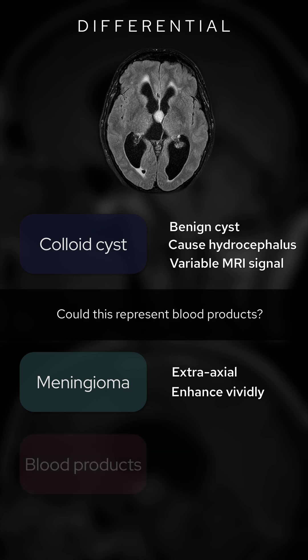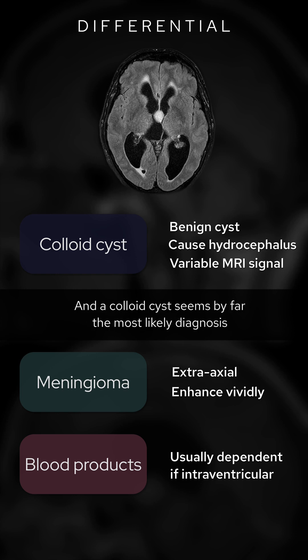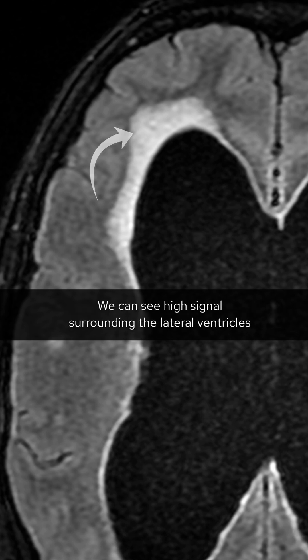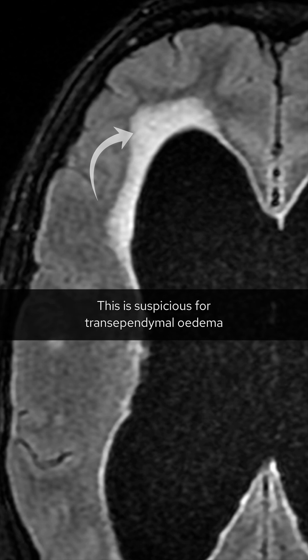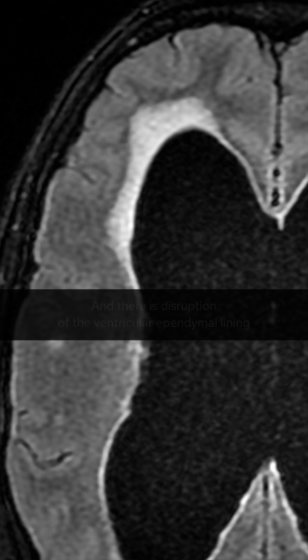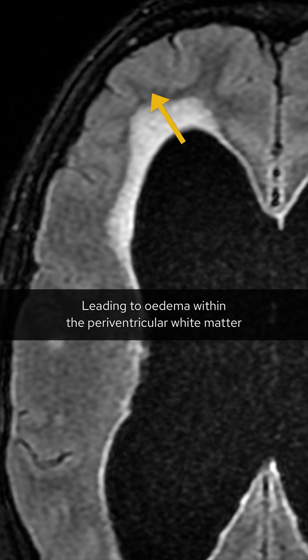Could this represent blood products? The well-defined nature does not really fit with this, and the colloid cyst seems by far the most likely diagnosis. Going back to the FLAIR sequence, we can see high signal surrounding the lateral ventricles. In the context of dilated lateral ventricles and an obstructing lesion, this is suspicious for transependymal edema — a sign of acute obstructive hydrocephalus, where disruption of the ventricular ependymal lining leads to edema within the periventricular white matter.